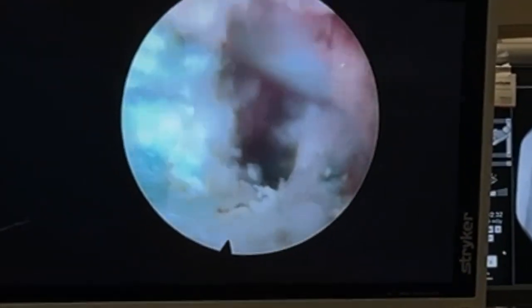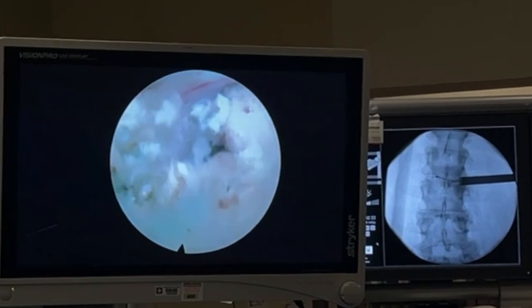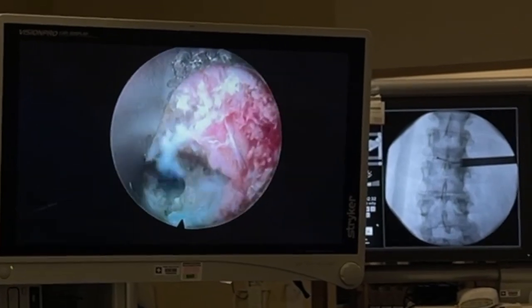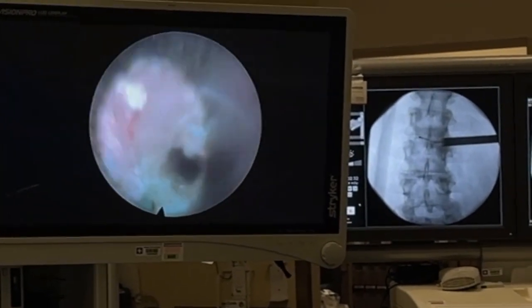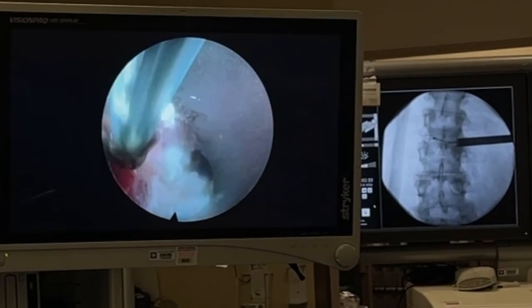Okay, look at how good of a view of the dural tube you have. I've also felt in there with the probe. There's a few, and now I'm backing out, and as I back out, I'm just looking around to make sure I'm not missing anything. You can clearly see that. Here's the exiting nerve root. It's surrounded by fat, but look how injected it is. Sign of bad inflammation. And if anybody's had a chronic inflammatory condition, they'll know how miserable it is.